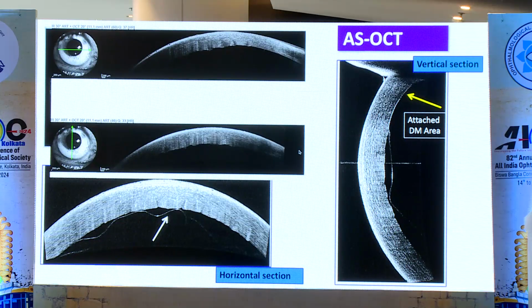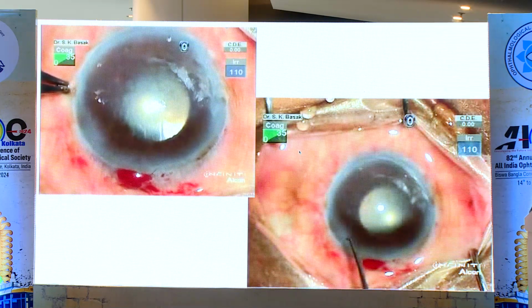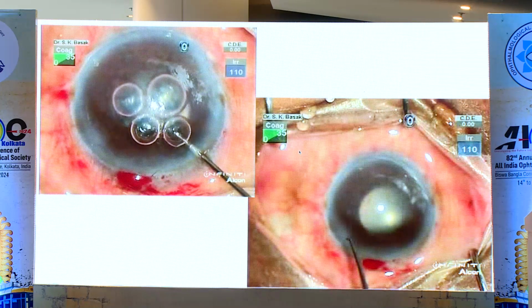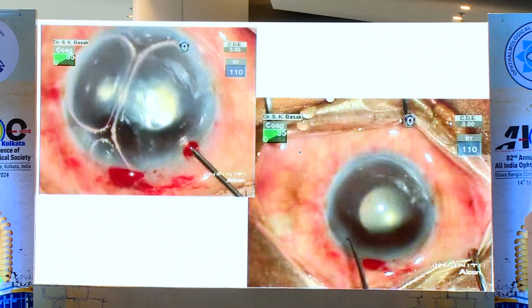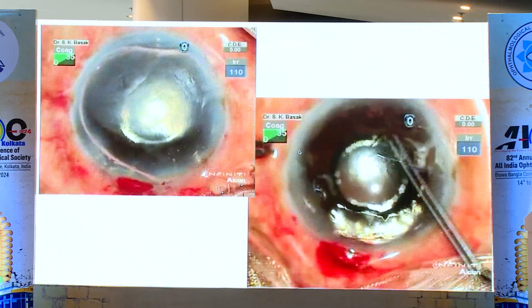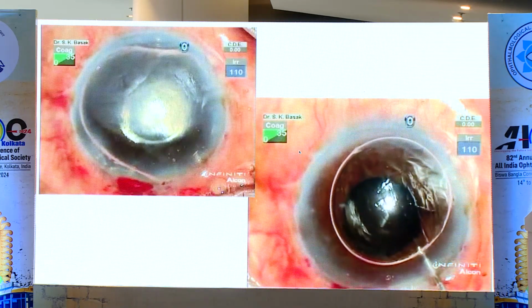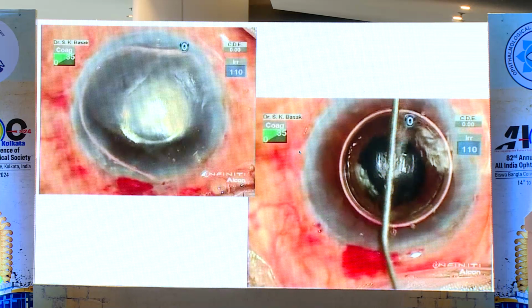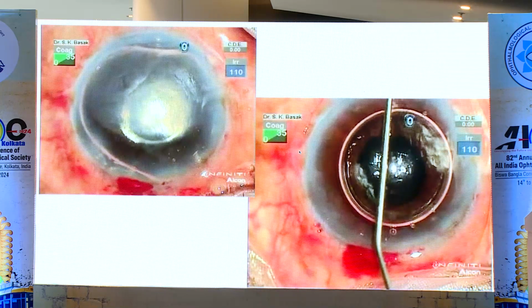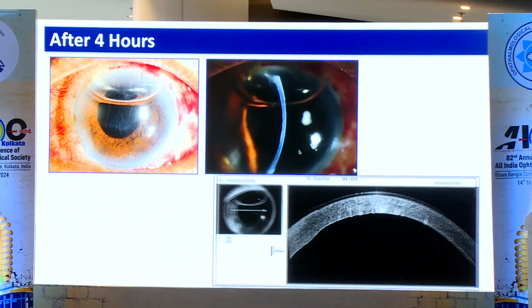This is the ultimate result of this OCT, and I make a side port, because the vertical one is not very extended, so I put the air. This we call the power of air. All endothelial surgery basically depends on the power of air. You go for DMEK, or DSEK, or you repair the Descemet detachment. Make it absolutely tight, make a bubble and keep it tight. If you make it very tight, wait for 30 minutes, then you can release some amount of air. After 4 hours, this is an absolutely clear cornea, and the Descemet is absolutely attached.